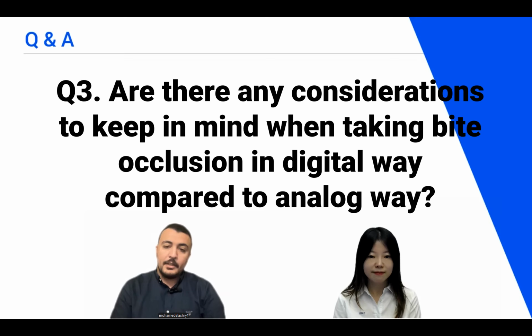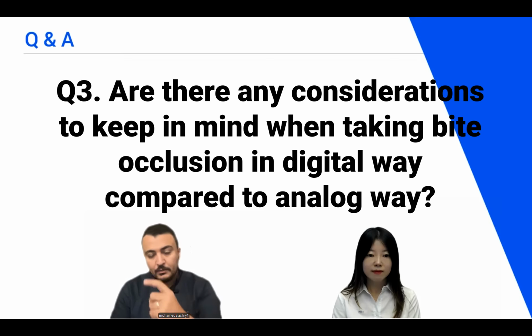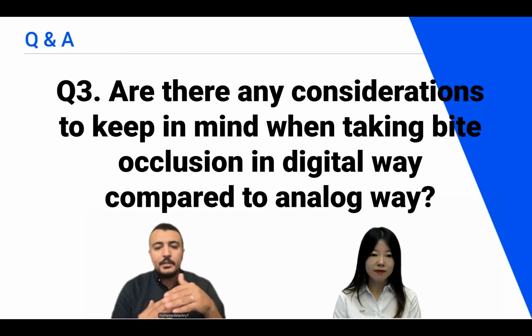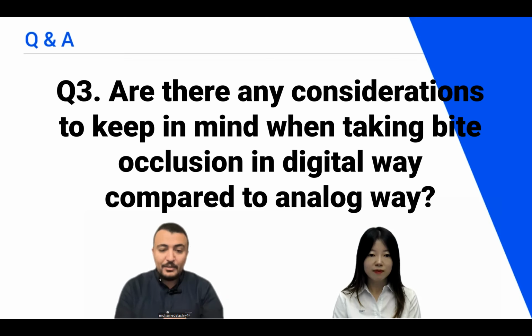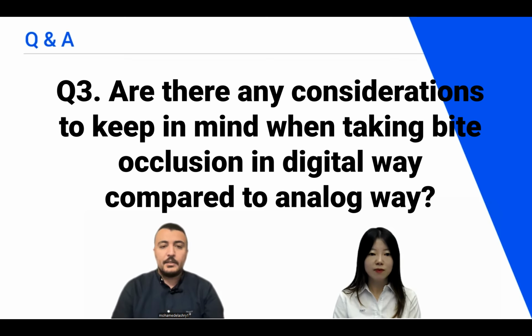Another important thing is that when you are recording the anterior teeth only, you have to scan the full arch. You cannot scan only the anterior teeth, because there will be an over collision or over tilting of the anterior teeth if you don't have posterior stoppers or if you did not scan the posterior teeth. The scanner will not understand that we have only anterior teeth without posterior teeth, so there will be slight collision or overclosure of the bite of the anterior teeth.